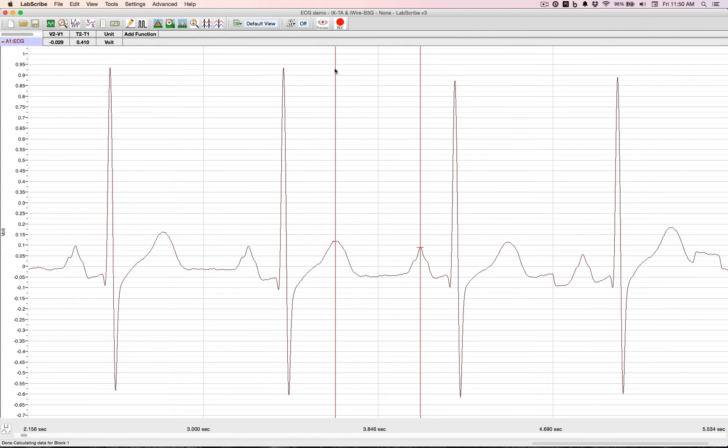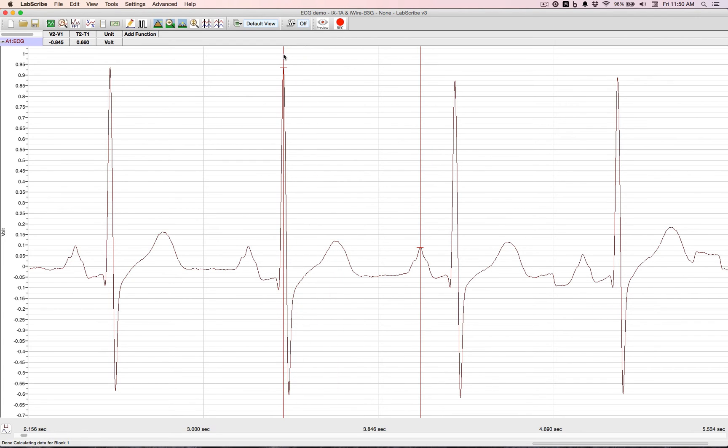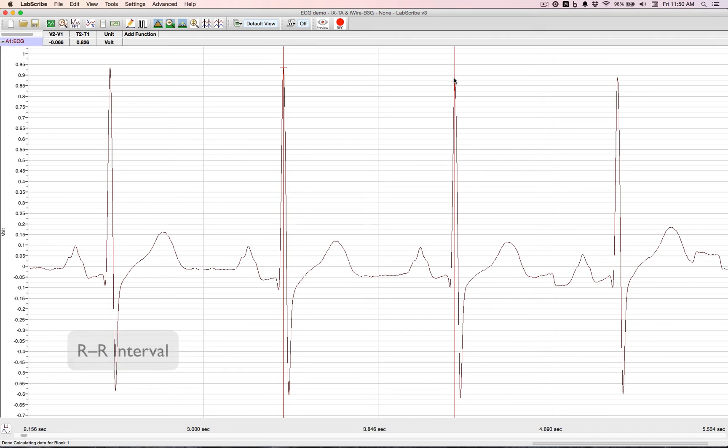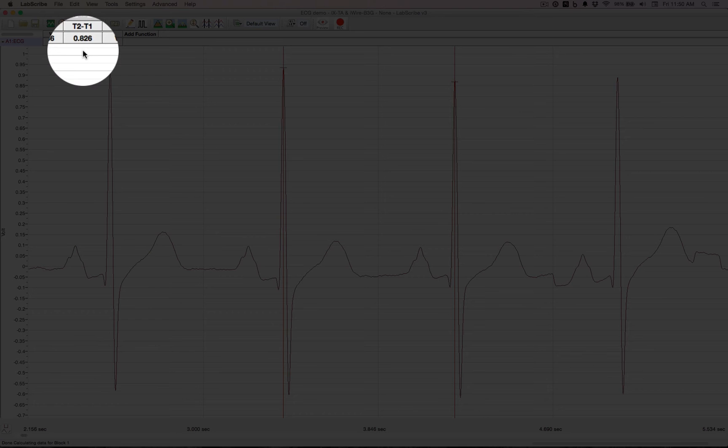And then moving the cursor to both R's, we have an R to R interval. That's 826 milliseconds.